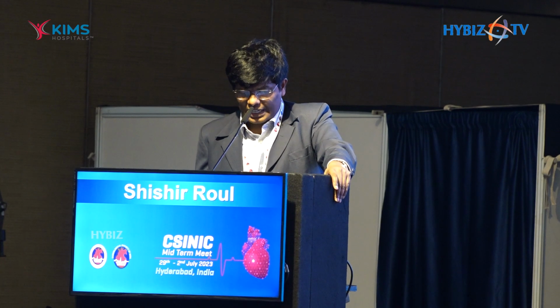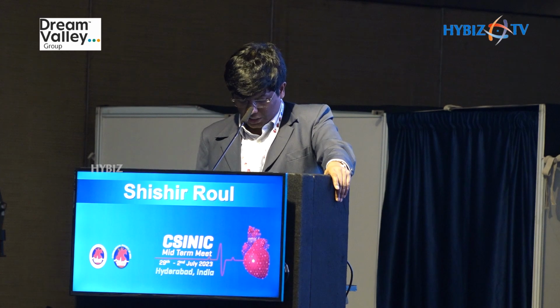So what is the criteria? Depth more than 200 micron, then medial involvement, angle more than 60, or the lumen area available less than 4, or length more than 3 mm. So they are predictors. This is an example of intramural hematoma. For a dissection, you can have stenting or DES, and for a minor dissection, you can leave it. For intramural hematoma, I can have ballooning or some sort of cutting balloon or stenting.